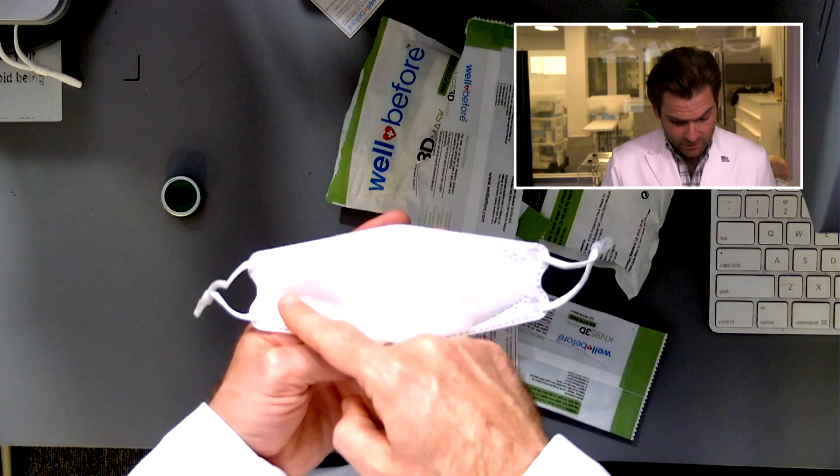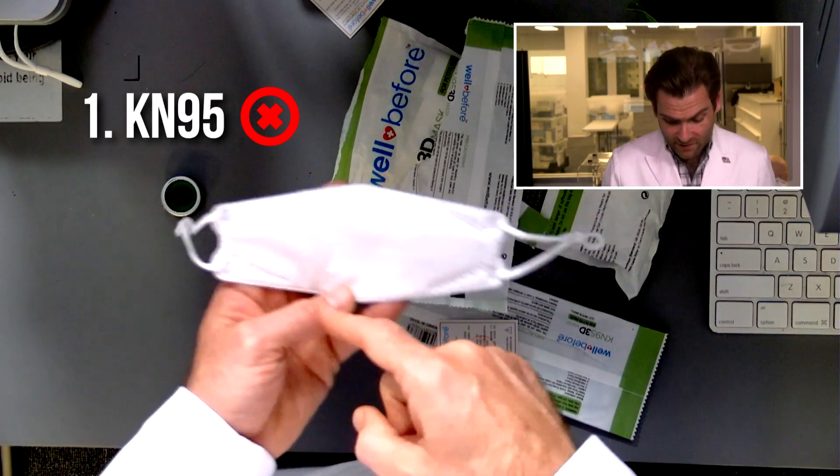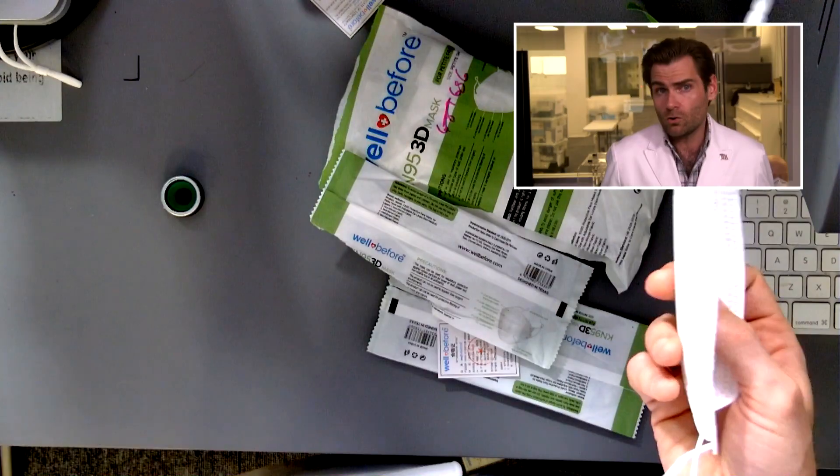To be a KN95 mask, you could have a style like this, but you need three things: you need it to say KN95 on the mask, you need to show the standard, and you need to have the manufacturer name. If this mask was just sitting by itself, you wouldn't know who made it — and that's a problem.